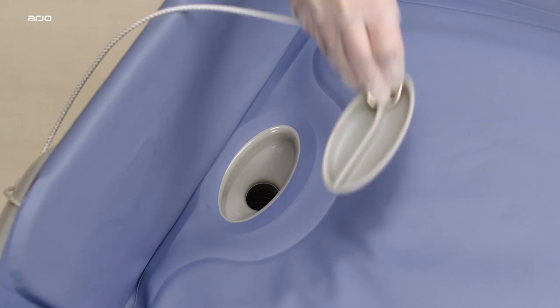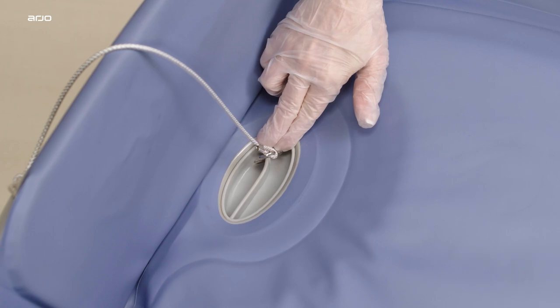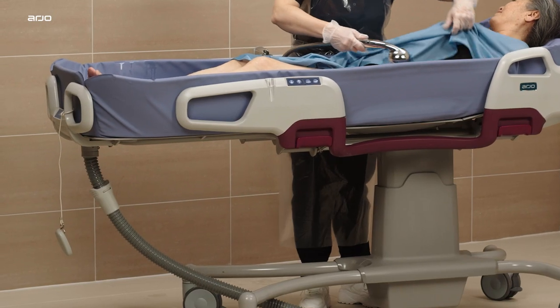To give a shallow bath, the drainage plug can be placed in the mattress drainage. When the drainage plug is not in use, let it hang freely.